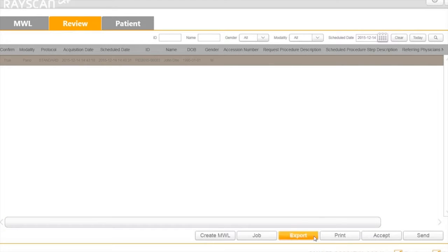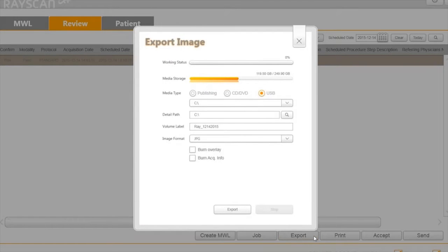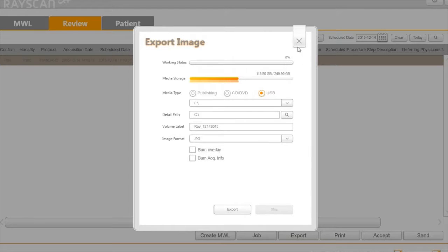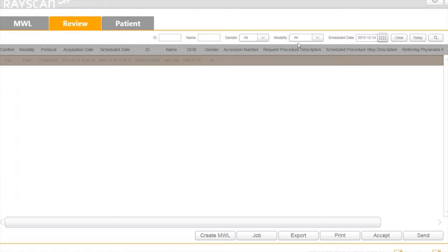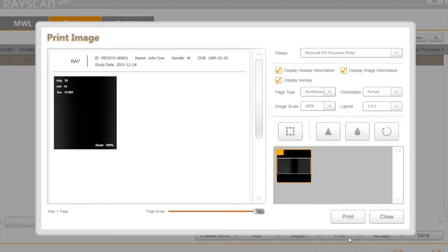The Export button allows users to export scanned images to any location in JPEG, DICOM, or RAW format. Simply click the Export button to finish. You can also print out or go to Report.